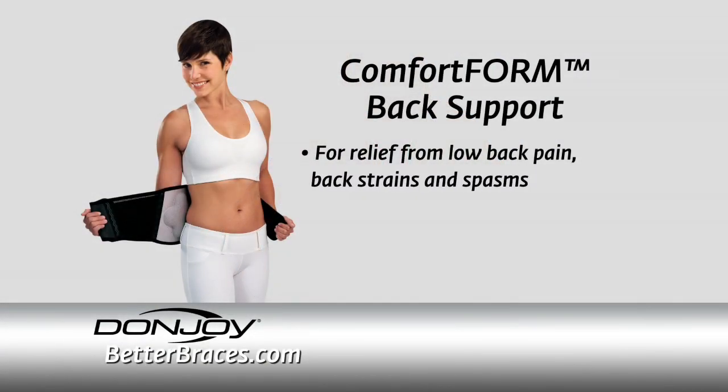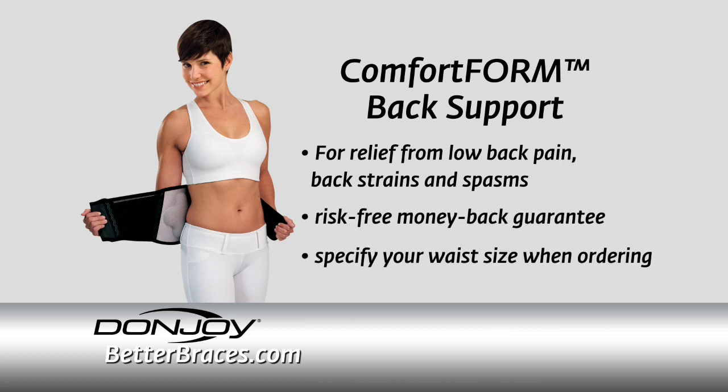For relief from low back pain, back strains, and spasms, try the DonJoy Comfort Form Back Support risk-free with our money-back guarantee. Be sure to specify your waist size when ordering.